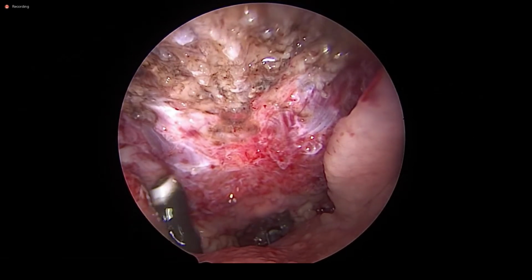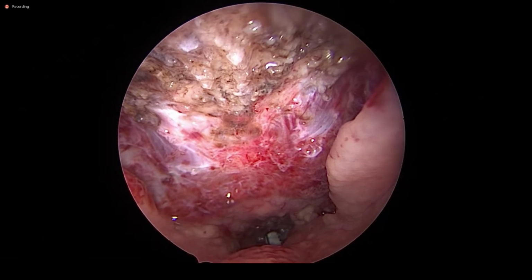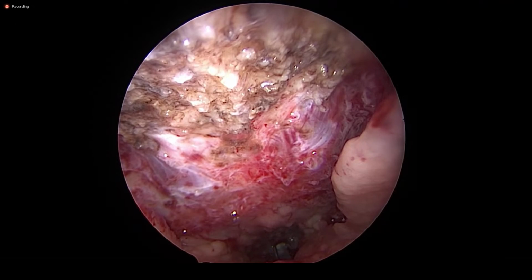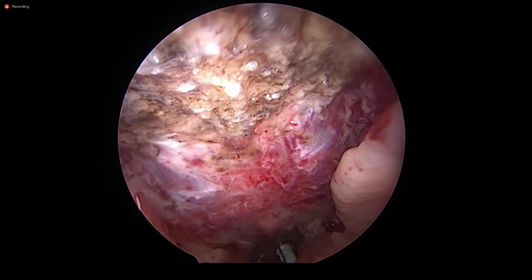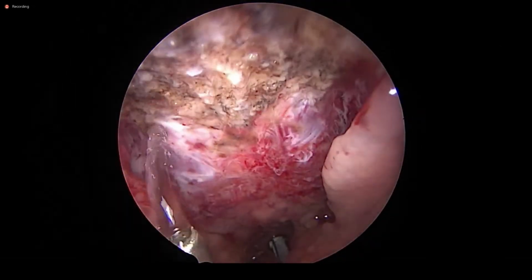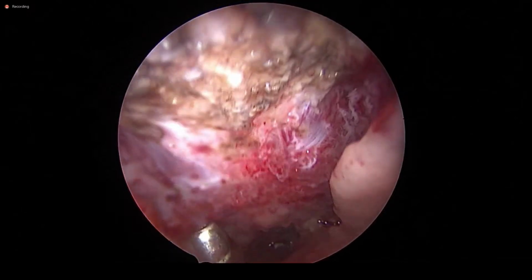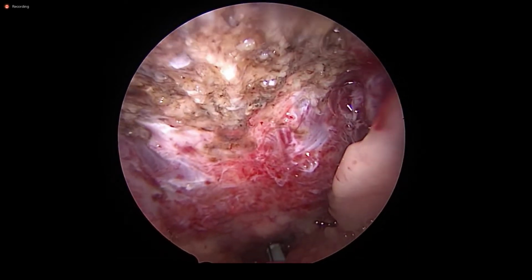So this is the way one can easily accomplish adenoidectomy. Most of the people I have seen finish at the level of what I did in the first stage, just luminal clearance. It is bound to give a persistent problem for the region you are operating, persistent adenoid. Complete clearance means complete comprehensive clearance for the regions you are working on.